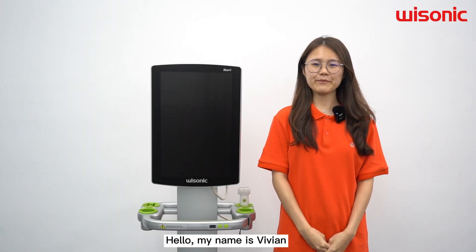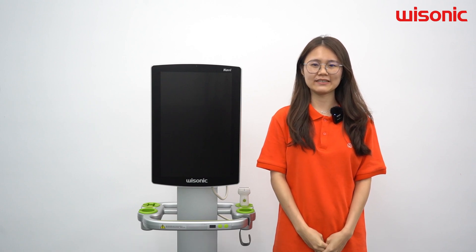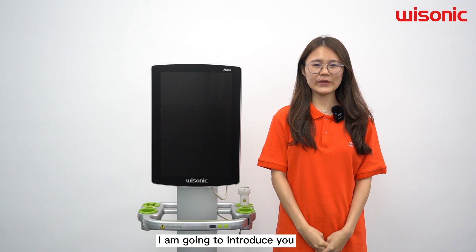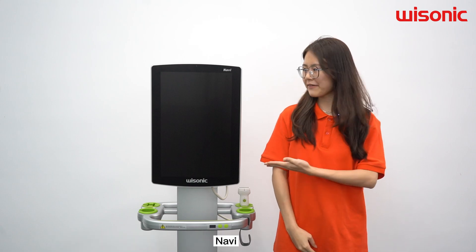Hello, my name is Vivian, the product specialist from Wisonic Medical. Today, I am going to introduce you to our premium anesthesia and pain management dedicated ultrasound, Navi.